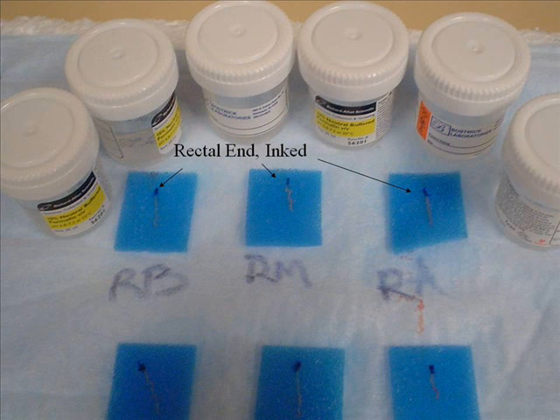After we get all the tissue specimens, we have to send each specimen in a separate bottle, so we know later on which tissue contains prostate cancer. So we get to know the exact location of your cancer within your prostate.